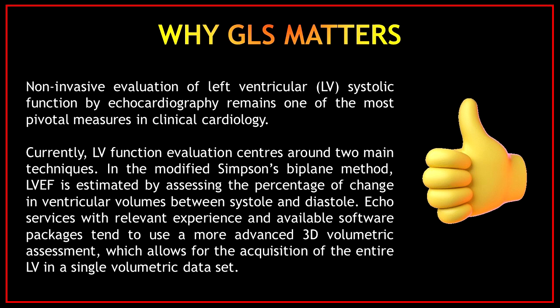Currently, left ventricular function evaluation centers around two main techniques. In the modified Simpson's biplane method, the left ventricular ejection fraction is estimated by assessing the percentage of change in ventricular volumes between systole and diastole.